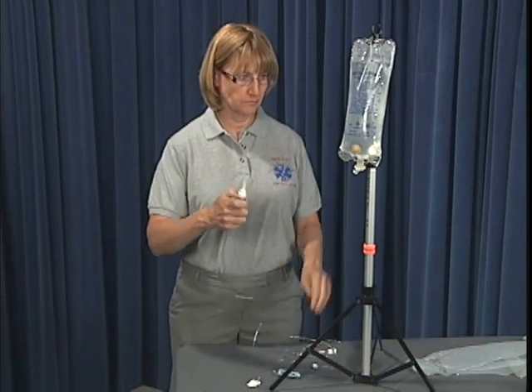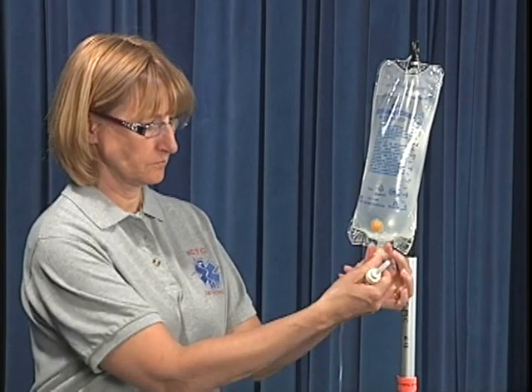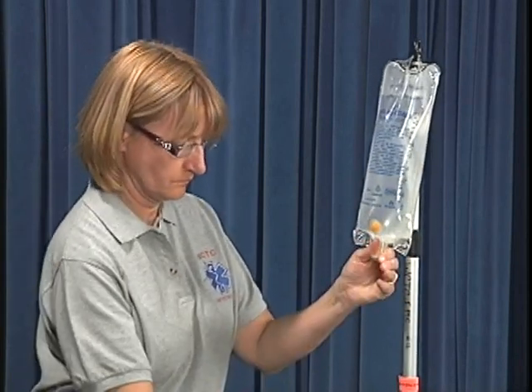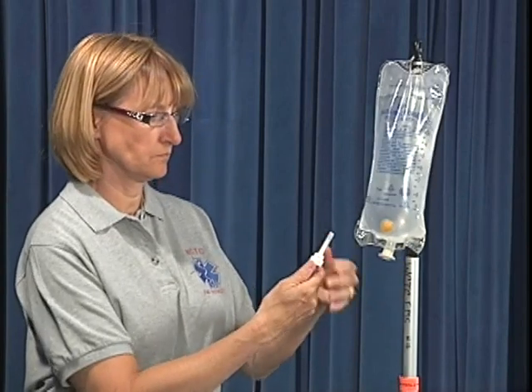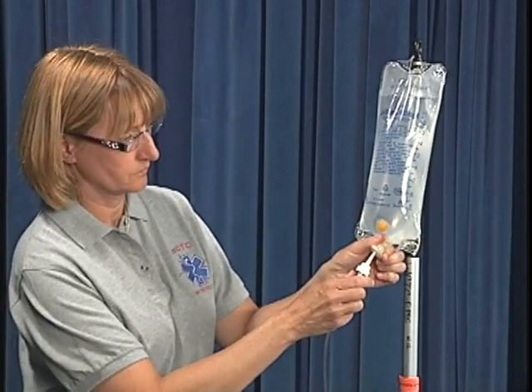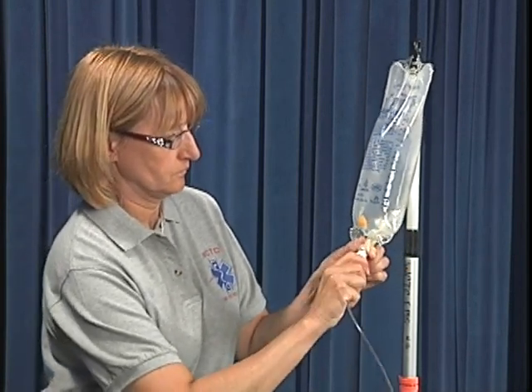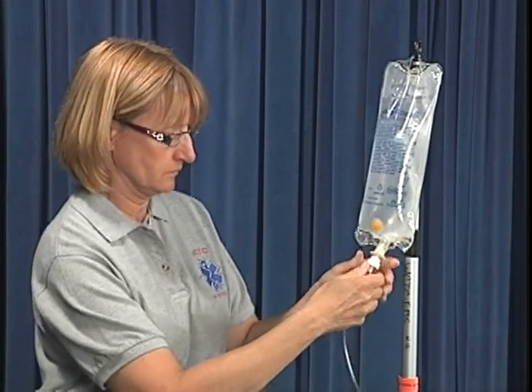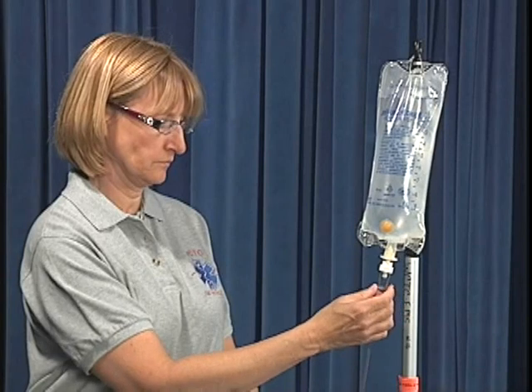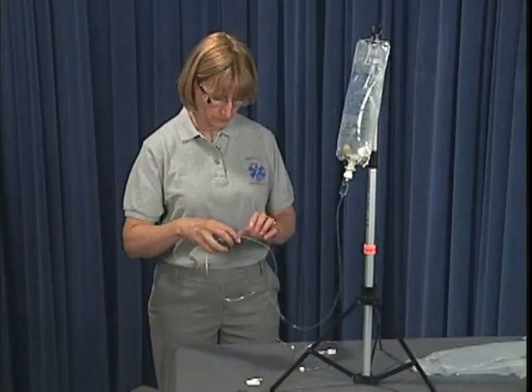Move the flow control clamp to the closed position and place it in a convenient location. Grasp the IV port just above the plastic tab and with the other hand pull the plastic tab from the port, being careful to maintain sterility of the port itself. Remove the protective cap from the IV tubing spike and insert the spike into the IV port by pushing with a twisting motion until the spike punctures the seal. Squeeze the drip chamber to fill it approximately half full of fluid.